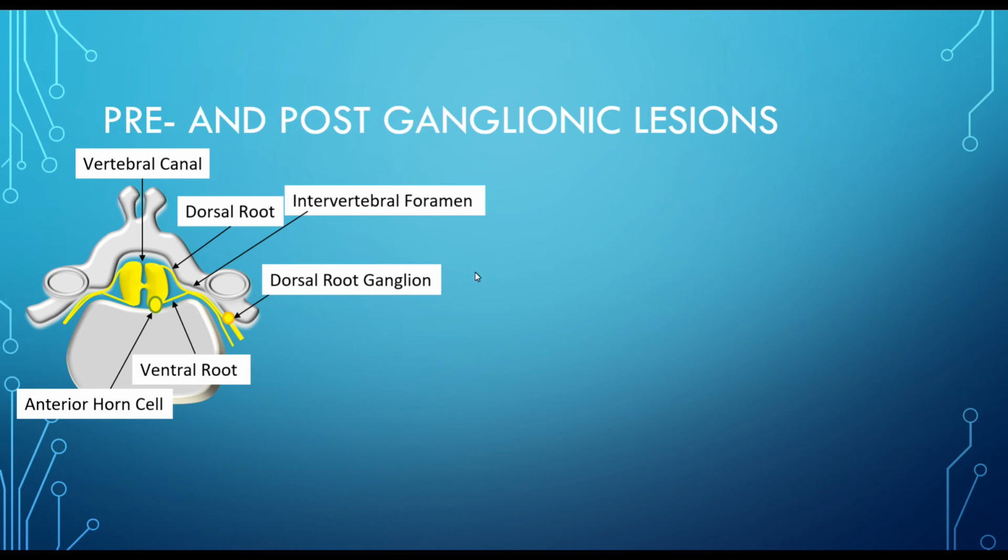In the case of the sensory nerves, that's the dorsal root ganglion. So we can test the nerves up to the dorsal root ganglion. It does not cover the distance between the dorsal root ganglion and its way into the spinal cord before making its way up. So the primary cell body is well outside.